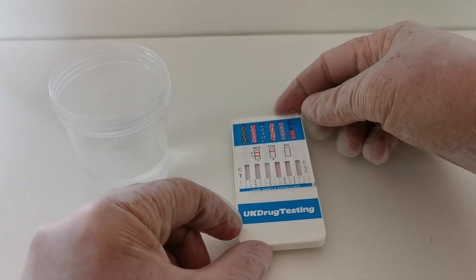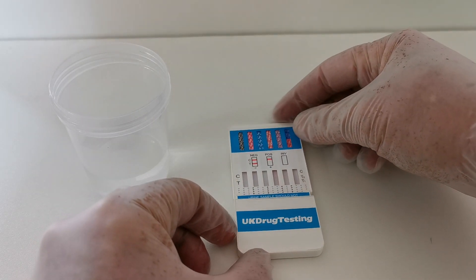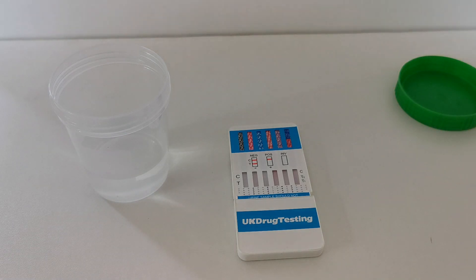Then place the sample panel flat and wait for the panel to react for the manufacturer's recommended read time. For most panels this is between 5 and 10 minutes. We're going to stop the camera and then demonstrate the results windows and how to interpret your results on this particular panel at the five minute mark.